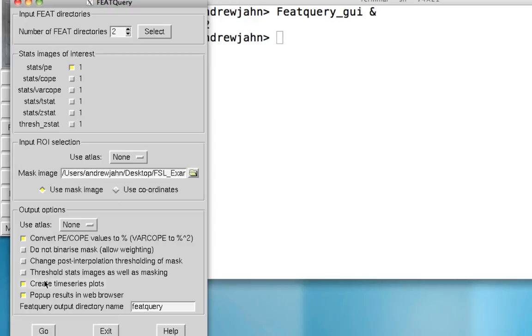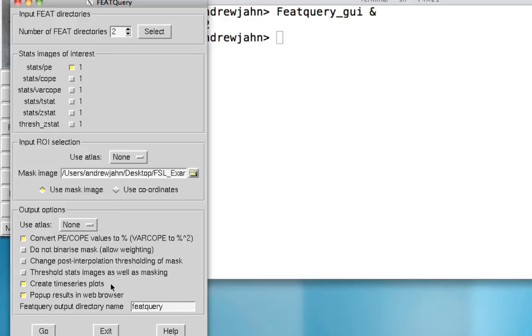It's also going to create a time series plot and a pop-up result in the web browser. This time series plot represents the number of time points within this region of interest. In this case, there were two runs, so it's going to generate two parameter estimates.